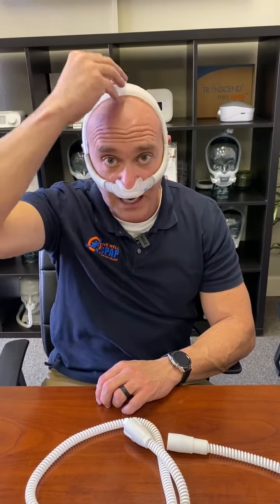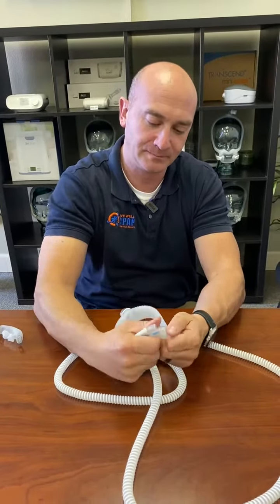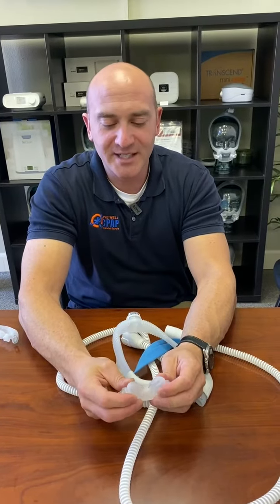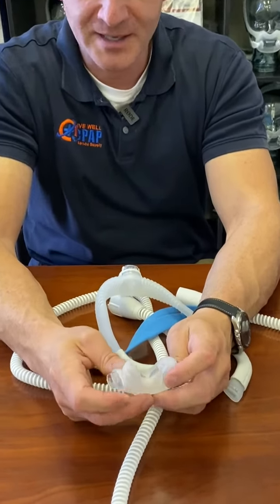You don't want it too tight, but you want it tight enough to where it's going to stay in place when you're sleeping and not move side to side too much. For women that have long hair or very thin hair and it tends to slide, I recommend pulling your hair up. It doesn't have to be in a ponytail, but make sure the headgear is down on your scalp, otherwise it will slide up and drop off in the middle of the night.